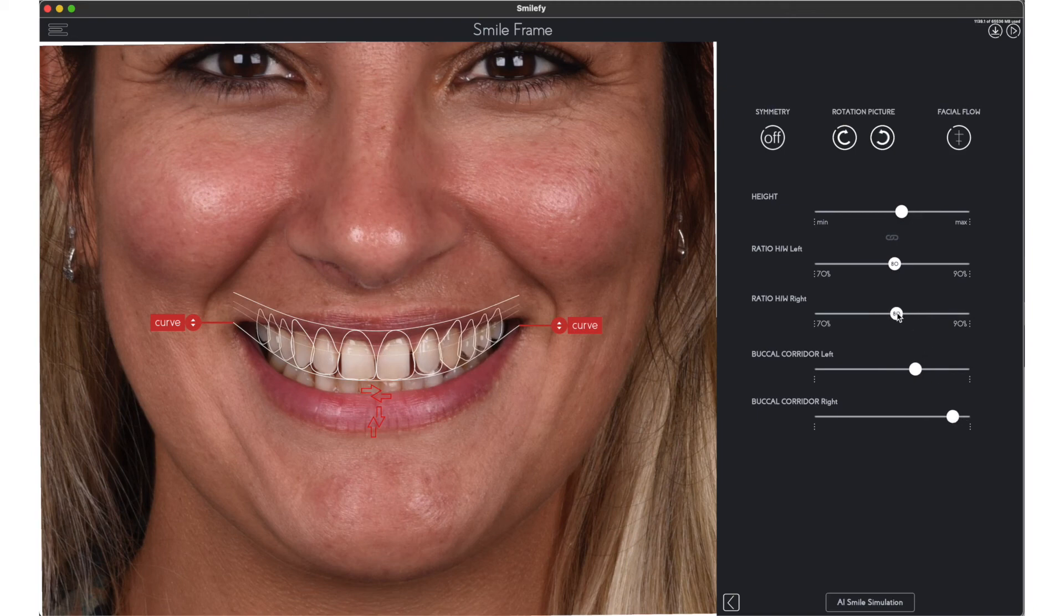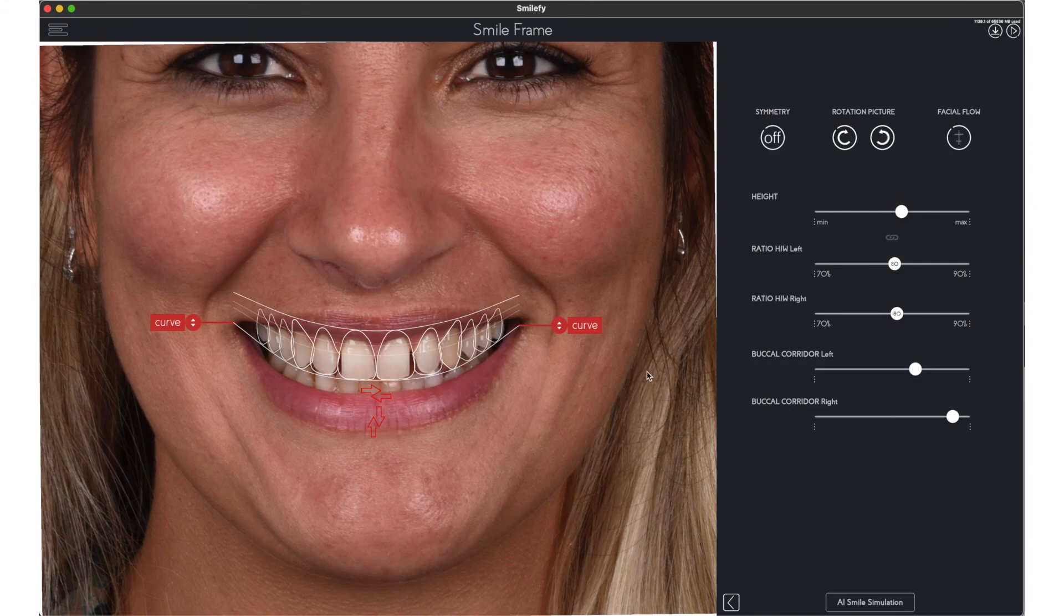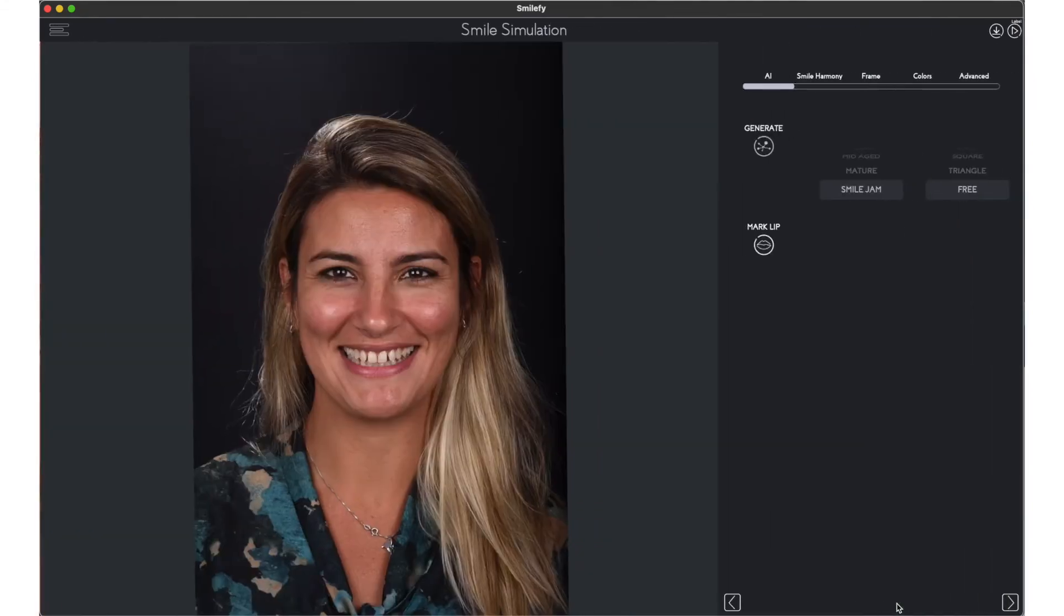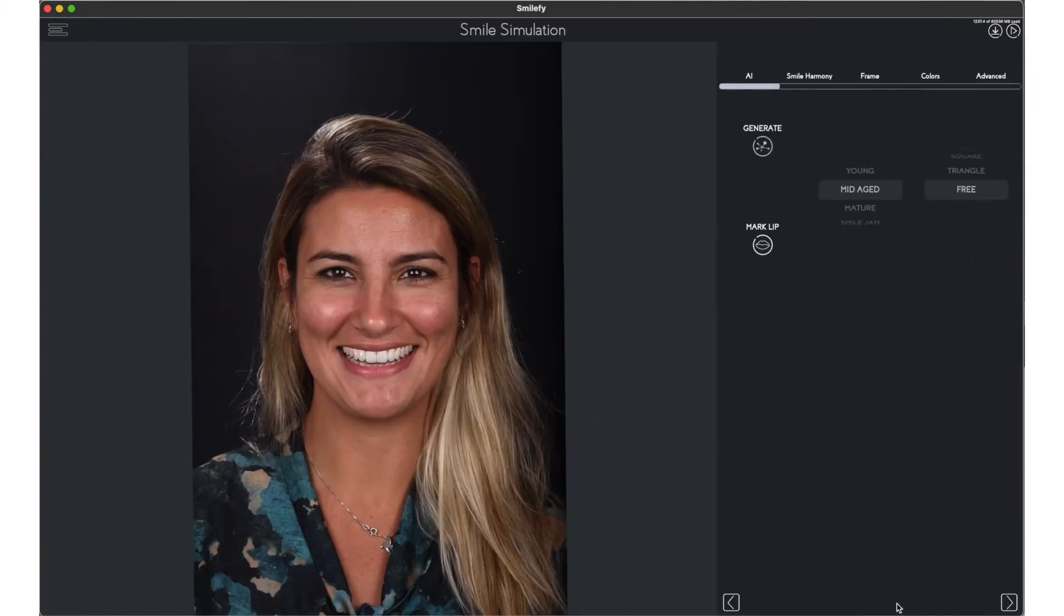The accurate adjustments of the smile frame will result in a quick and beautiful smile design generated automatically by the software.